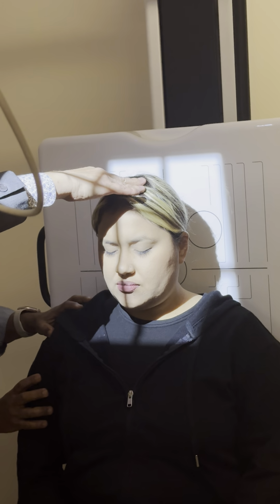She needs to tuck her chin so the OML line is actually produced on it. When she touches that, it'll make it go up to the level I need. Here we go. Hold your chin like that. I know it's hard. You'll notice the light will transfer across the orbit.